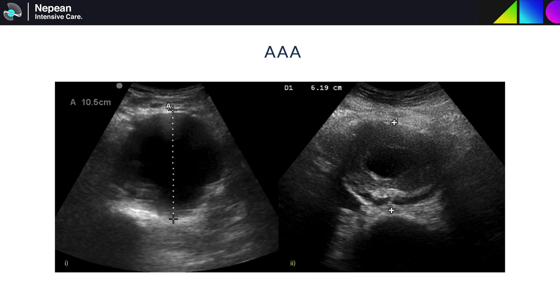An aneurysm is a focal dilatation of a blood vessel that measures over 3cm in diameter, with the most common type being a fusiform aneurysm. Saccular aneurysms can also occur — these are asymmetrical localised dilatations forming a sac-like swelling, more commonly following trauma to the vessel. Ultrasound is very good at recognising the presence of an aneurysm but has poor sensitivity for identifying a rupture or leak, which is often retroperitoneal. So generally, if you see an aneurysm in someone with a consistent history and shock, urgent CT should be the imaging of choice. The image on the left shows a very large AAA of 10.5cm with calipers used to measure the AP dimension. In the image on the right, the aorta may be mistakenly considered normal in diameter due to the presence of mural thrombus — the correct method for measurement is from outer edge to outer edge of the vessel.